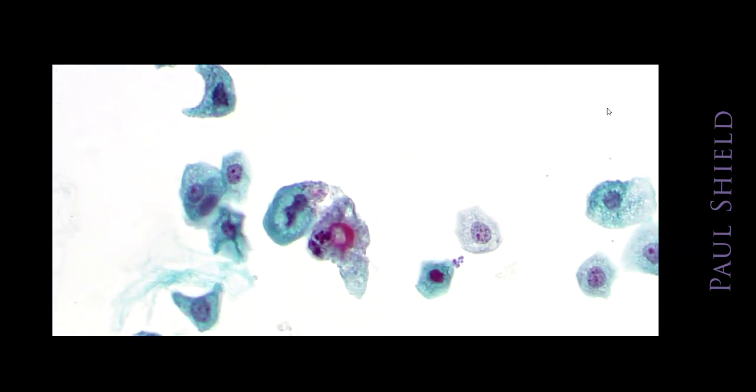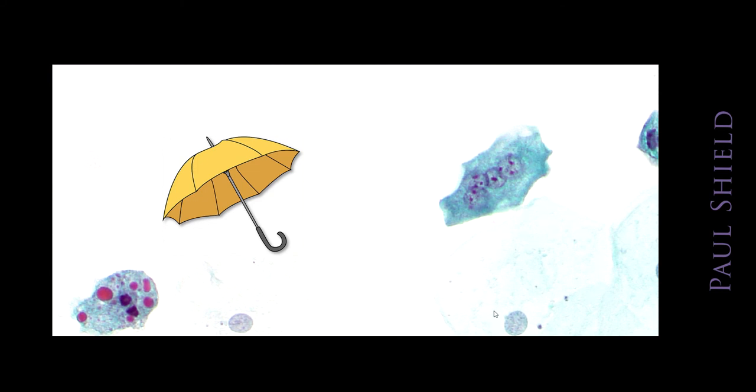You can see they're a lot like squamous cells. They have a central nucleus and a moderate amount of cytoplasm. But the cytoplasm, notice, is sort of more transparent. It's less homogeneous. Nuclei are round and oval and pretty uniform, and the NC ratio is not terribly high in these cells. Chromatin is fine and even, and you'll notice there's little nucleoli often present in urothelial cells.